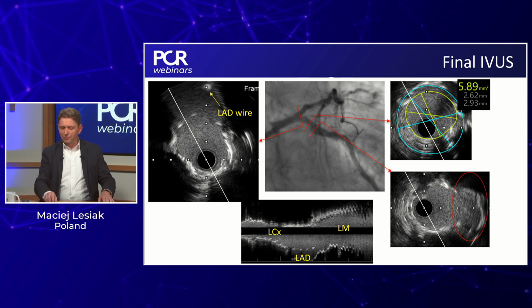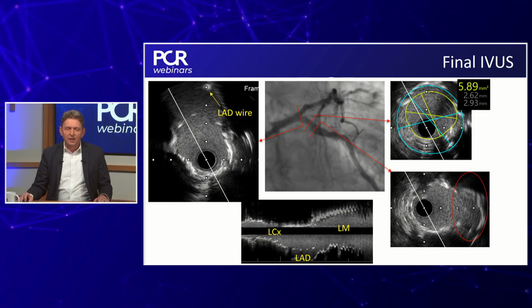Can we come back to precise stenting? I like this question from Anastasia Skoromna very much. Have you checked simultaneous IVUS during the stent deployment? So you position IVUS towards the LAD, and then you pull back until you see it, and then deploy. I think that's one possible way to make sure that we don't... Yeah, it could be possible, because we use, in most cases, a 7 French catheter, so it's doable with the setup we had for this patient, but we didn't do this. Sorry for interrupting. I thought it's important to share with our colleagues. Of course, that's a good idea.